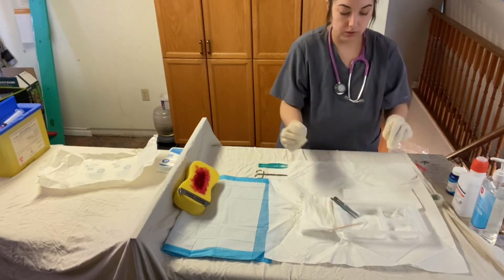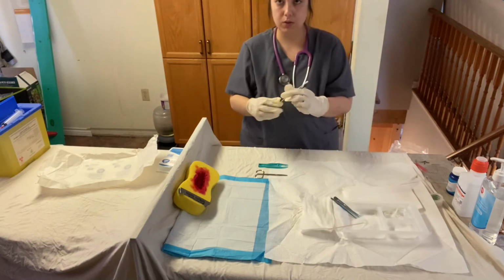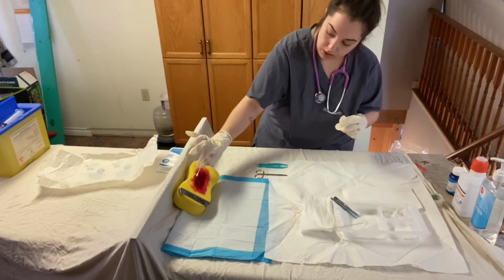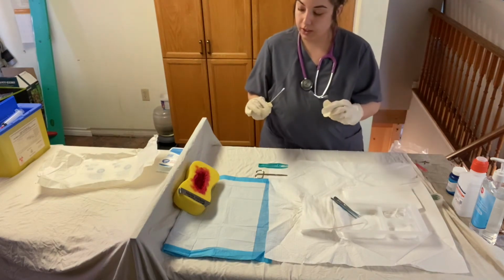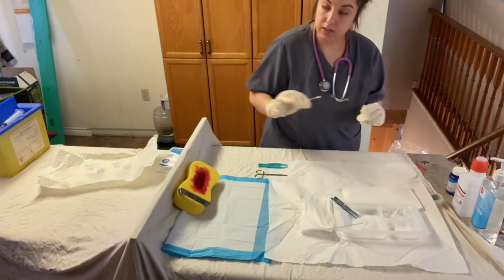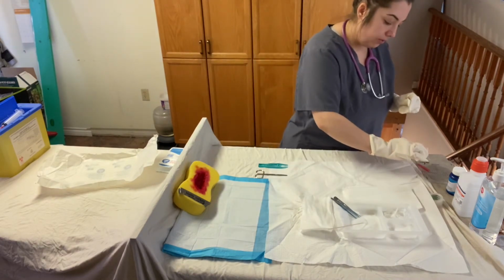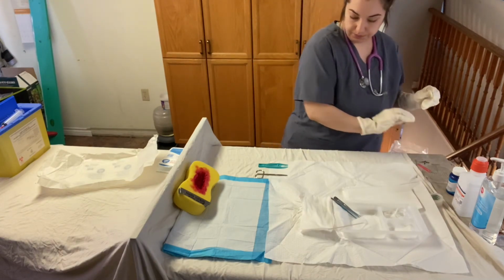Next, we're going to use our cotton tip applicator to measure the wound. So we always want to measure length times width times depth. So without touching the wound in any way, without the cotton tip applicator or my gloves, I'm going to measure the wound. I have my ruler here. It seems to be about 4 inches in length, 2 inches in width, and then for depth, again, not touching, about 1/2 inch for depth. I'm going to dispose of this now.